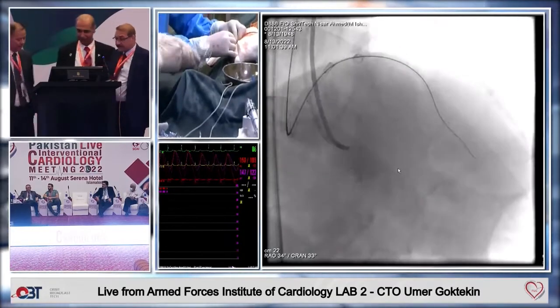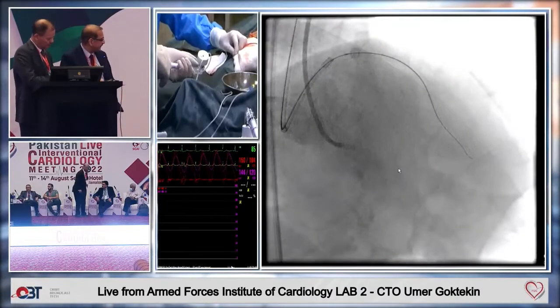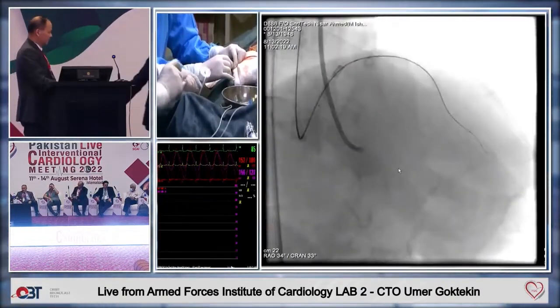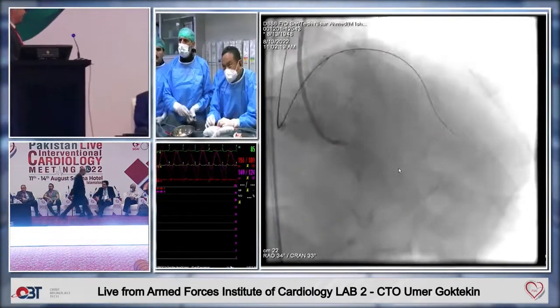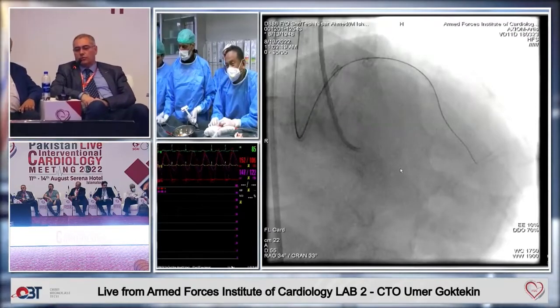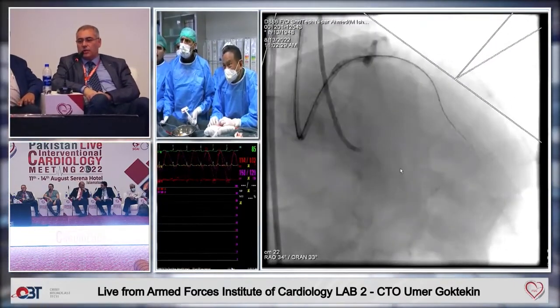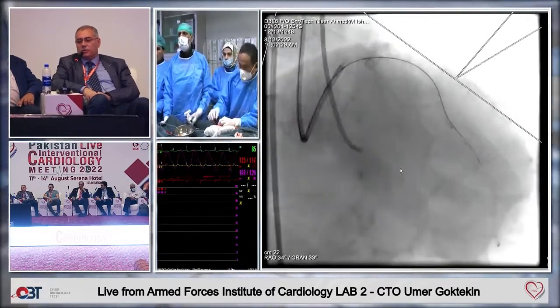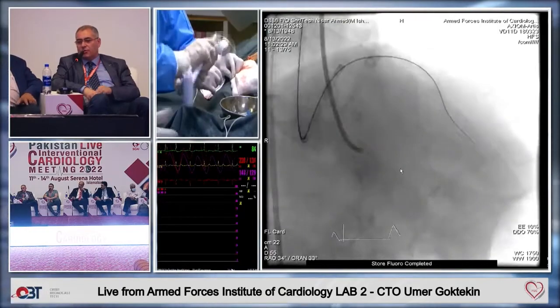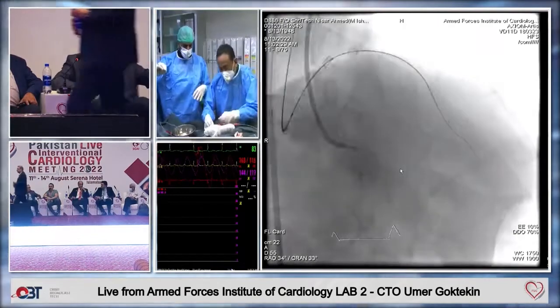We have the Turkish experts here as well, Dr. Wallström. What is your experience in this case, and any comments or anything you want to ask Rosalie? He had a perfect crossing coordination. I think the micro didn't go through, so we should dilate the vessel, exchange with an extra support guide wire, and it's better to do IVUS for this patient to learn the mechanism of the restenosis. Probably it's malapposed or there is under expansion. So usually I keep this until I change over.